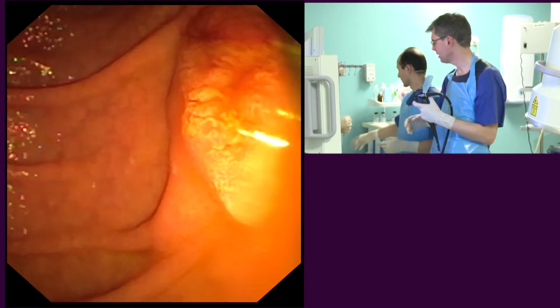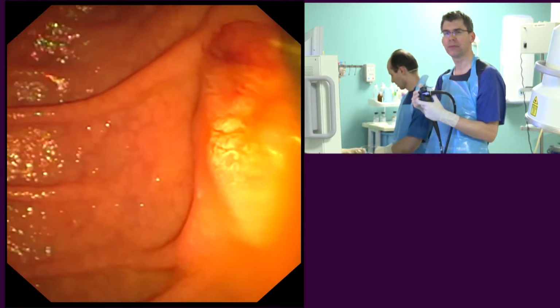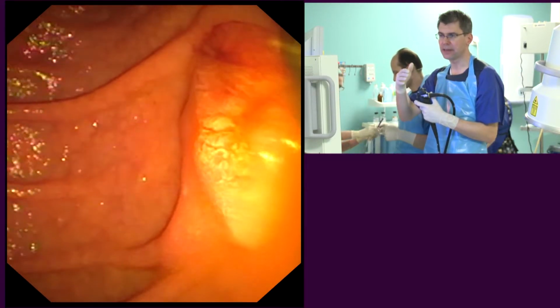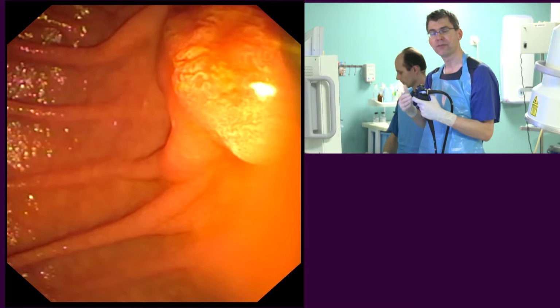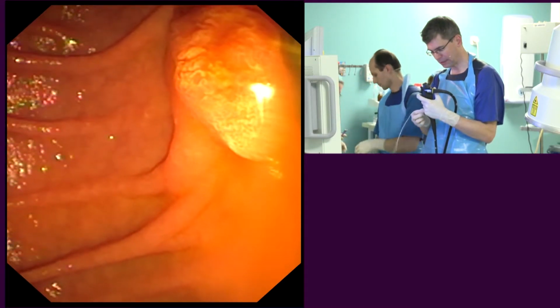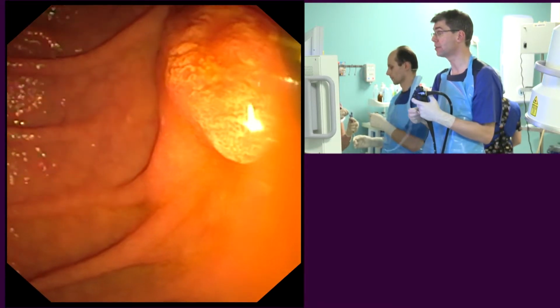The interesting question here is, how does the inner wall of the biliary tract look? Because now we've got the presumed diagnosis of primary sclerosing cholangitis, an inflammatory disease of the biliary tract. The problem, as you will know, is the high risk of malignancy in those patients.